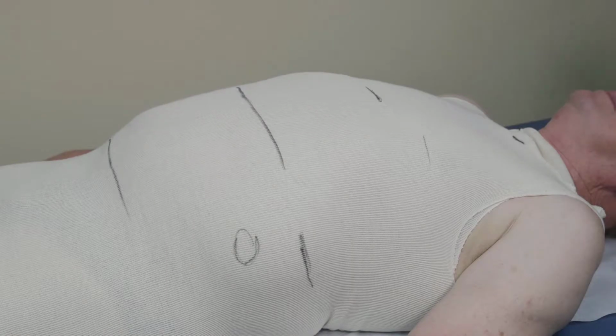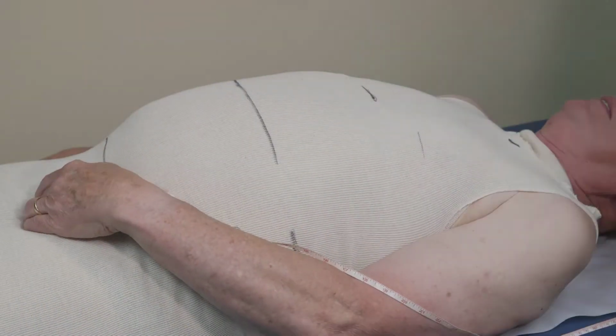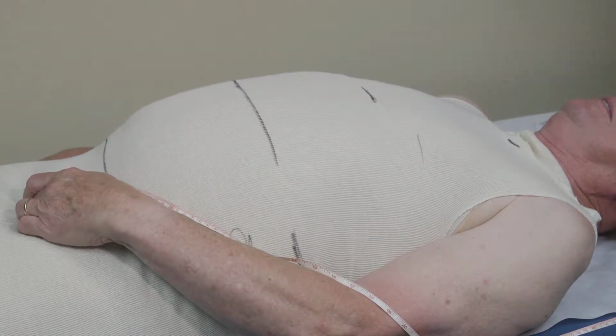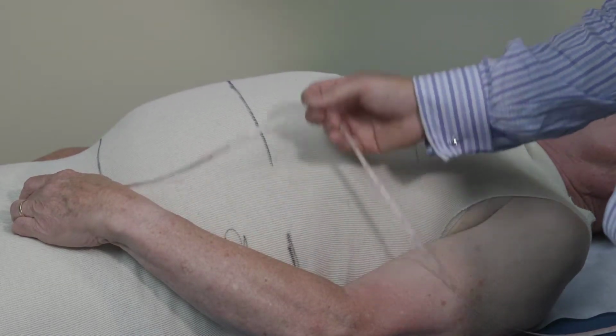I'm going to come over here. All right, Bob, if you'll do the honors on this. Let me start over. Okay, so he put the distal aspect of this tape measure at his symphysis pubis.